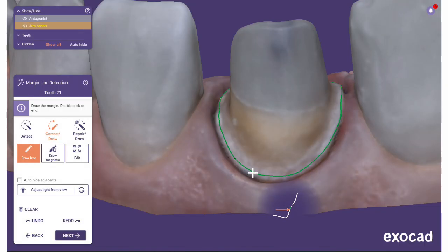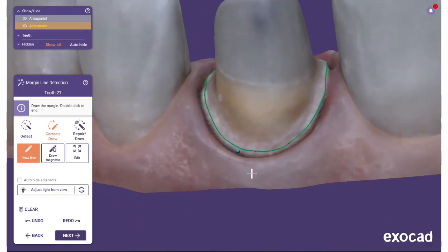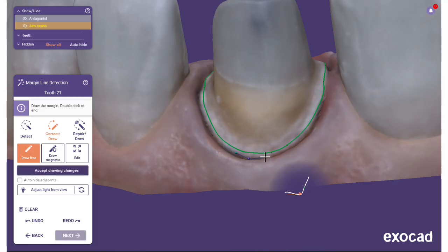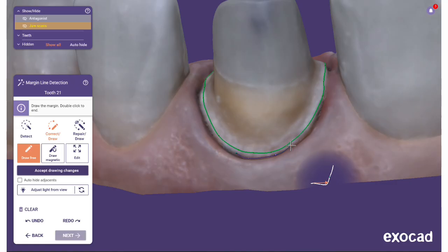Draw Free: set points along the margin line by clicking the scan to complete the margin line. Double-click the latest point or click Accept Drawing Changes — it will be automatically connected to the first point. The line will appear green and the active button will automatically switch to Edit.